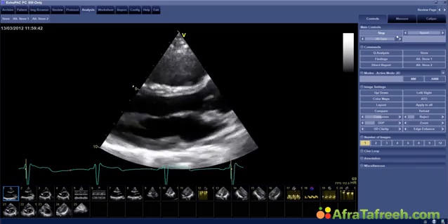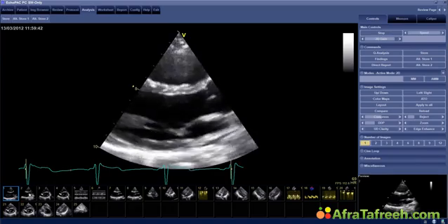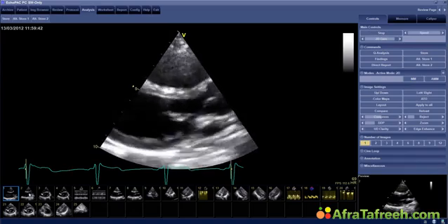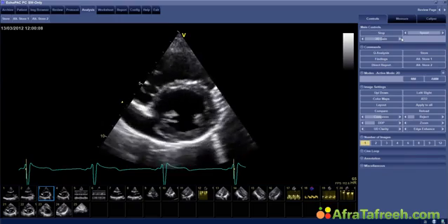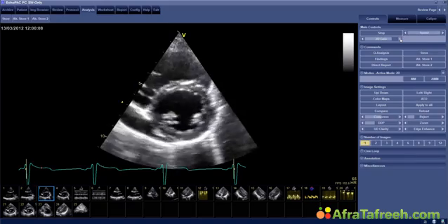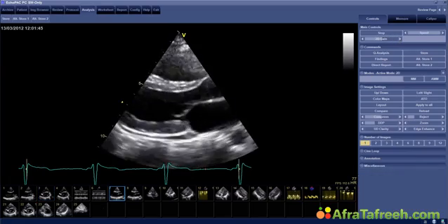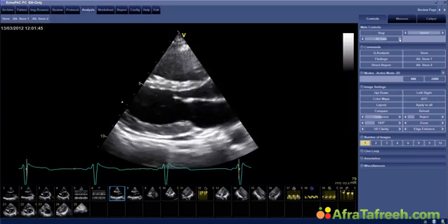with chemotherapy, and obviously this echocardiogram was performed with the question, can chemotherapy be continued? Do we have any toxic effects of chemotherapy on the left ventricle? This is a very crucial question, obviously, because if you say left ventricular function is reduced, this would mean no more chemotherapy, which in some instances could really make a difference to the patient, because you cannot treat him for his tumor. So take a look at these images.